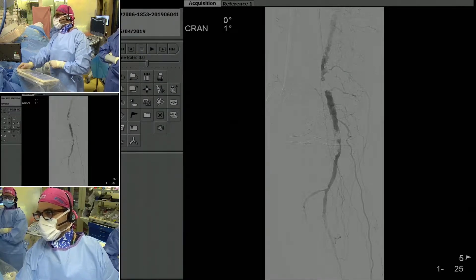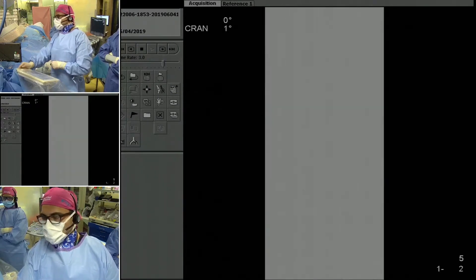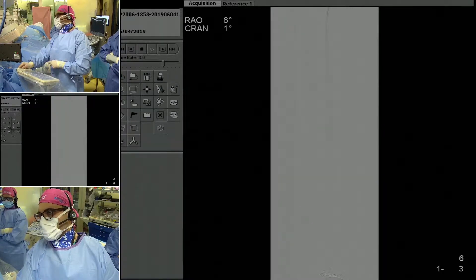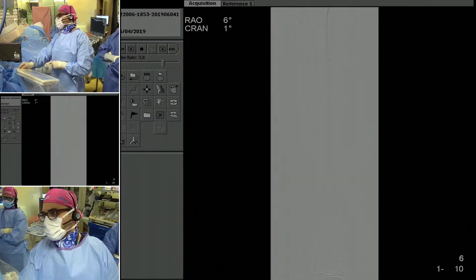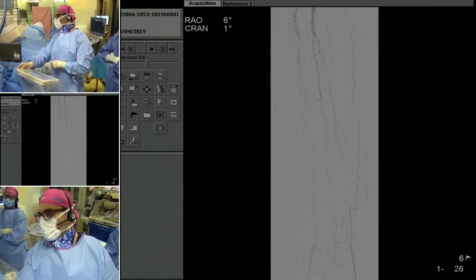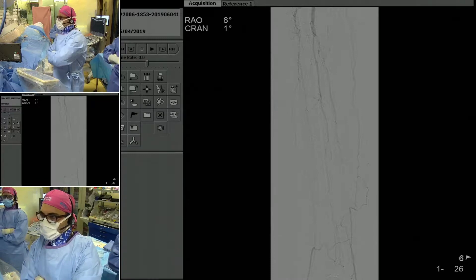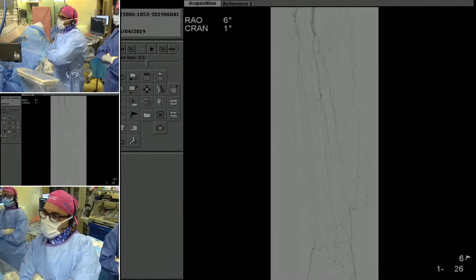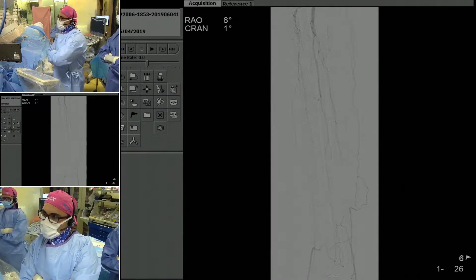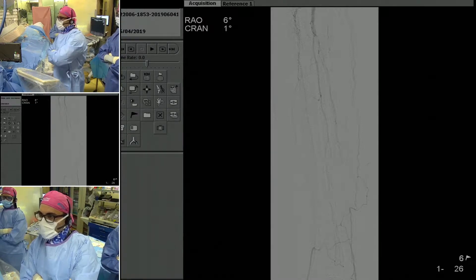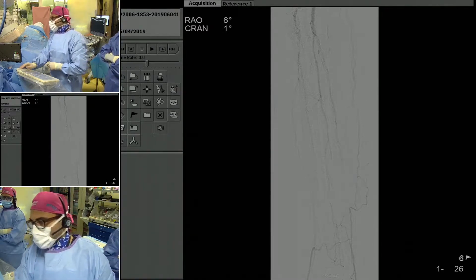These are our two proximal lesions in the popliteal artery. As you go distally, there is tibial disease. There's multi-vessel tibial disease — an occlusion of the distal posterior tibial, the anterior tibial is also occluded, and the distal third of the peroneal is also occluded. This is a very difficult transradial case.